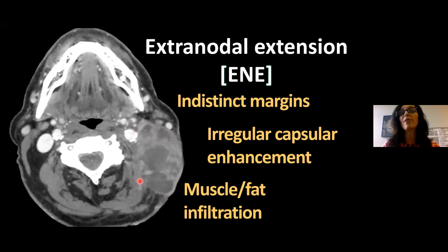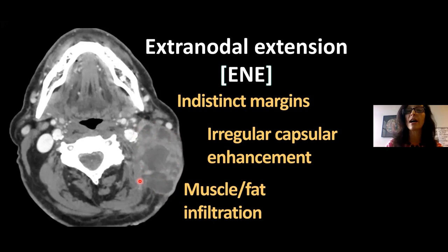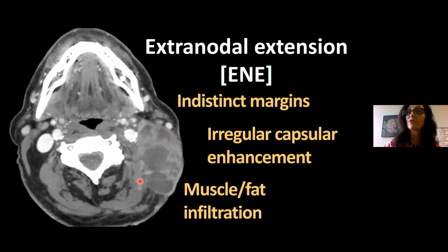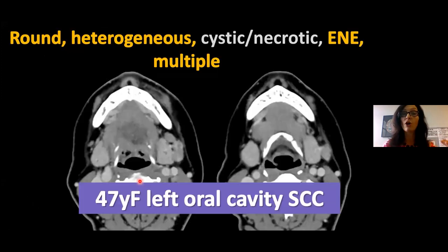Extranodal extension is the most specific imaging sign of malignancy. We're not terrifically sensitive for it, but when you see it, call it. This big, very heterogeneous nodal mass extends all the way through to the dermis — almost coming out through the skin and infiltrating muscle. This is extensive extranodal extension.